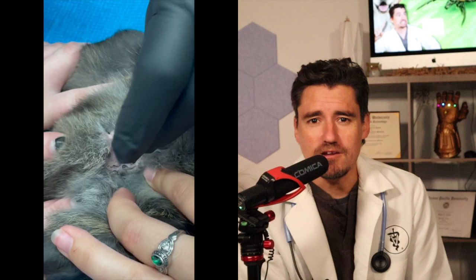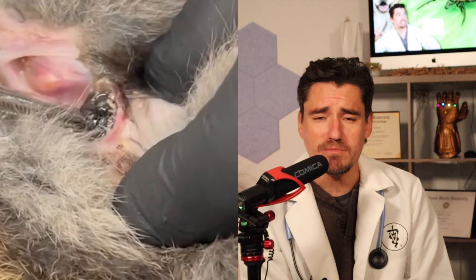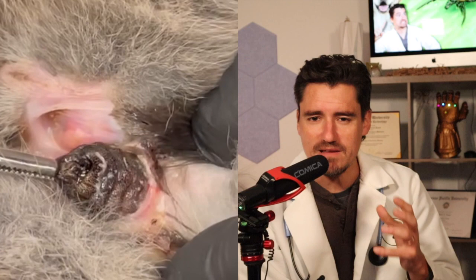Now you need to be careful because if you go in there and just pull them out and they tear or rupture, that's gonna lead to a lot of inflammation and infection. You want to get the whole bot fly out, because if you pull too hard and tear it or break the bot fly, that will lead to a localized inflammatory reaction which is a lot harder to clean up. Also, these bot flies have hairs that are kind of barbed, which makes them hard to pull out. So you want to go very slow and controlled as you pull the bot fly out.